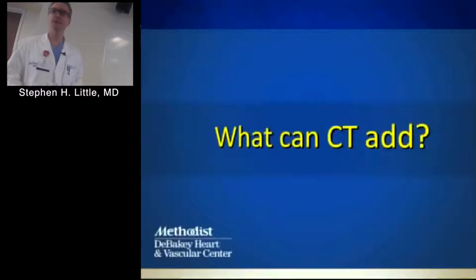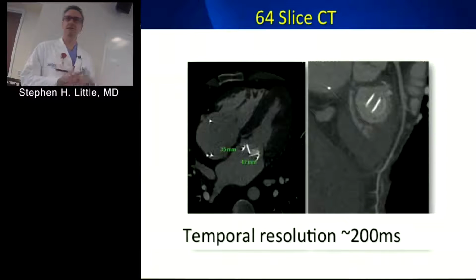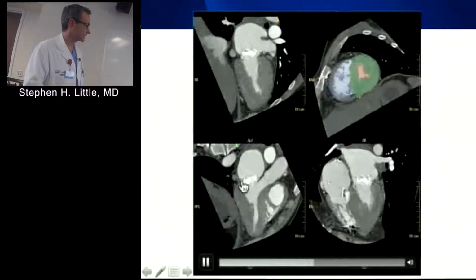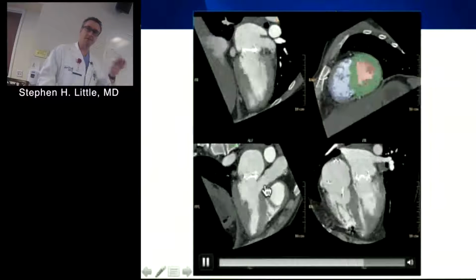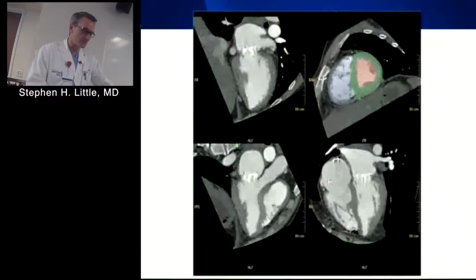CT can define prosthetic valve dehiscence, the extended dehiscence, whether it's acute endocarditis or chronic. Sometimes they do survive the chronic event, or even the event isn't recognized. Nobody realizes they had endocarditis, it clears, and now they've got a paravalvular defect that they need plugged. So typically it's either a peri-mitral event or a peri-aortic event, and it's usually not to visualize the vegetation, it's to visualize the extent of destruction. That's usually where CT plays a role.